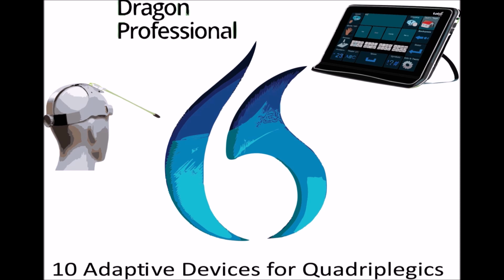Electric wheelchairs are typically used by individuals with physical disabilities that affect their ability to walk or use a manual wheelchair. They can provide greater mobility and independence, allowing individuals to navigate their environment more easily and participate in daily activities. Electric wheelchairs can also be customized with various assistive technologies, such as a headrest, footrest, or joystick extension, to accommodate the specific needs and preferences of the user.